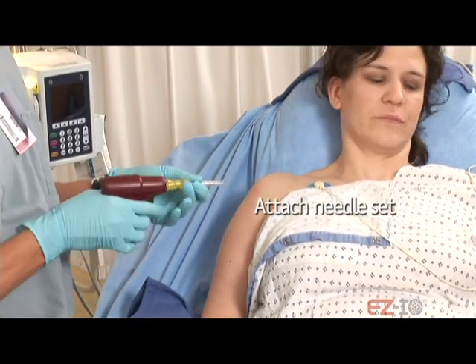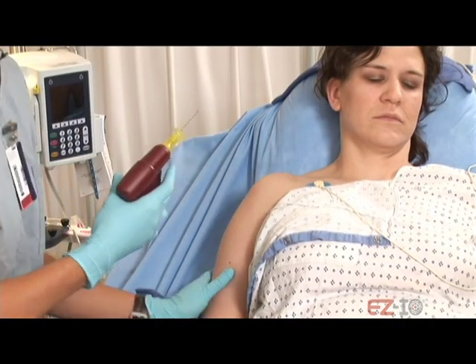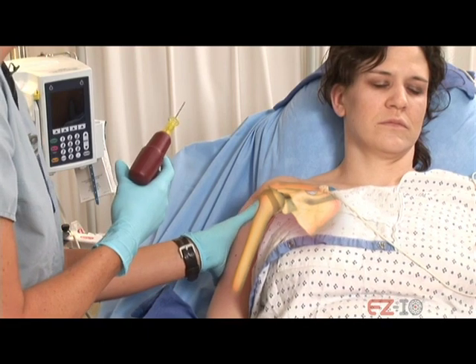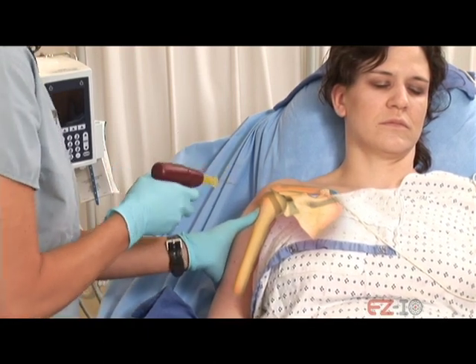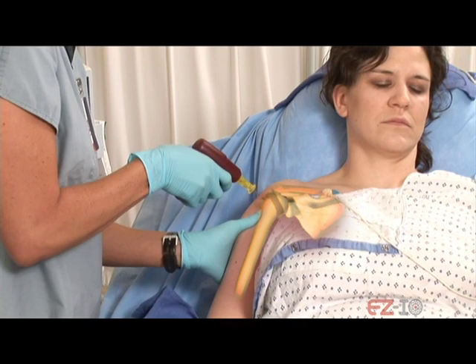Attach the needle set to the power driver and remove the safety cap. Okay, now what I'm doing is just coming up and finding that spot again. Insert the needle through the tissue until it's touching the bone. Verify there is sufficient needle length by ensuring at least one black line is visible above the skin.